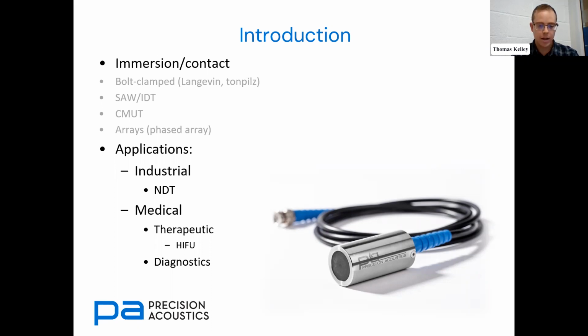Having said that, medical diagnostic applications, they quite often use arrays. I'm not going to talk about arrays too much today, but they are contact transducers typically. So there's a bit of an overlap, as there are with a lot of things in transducer design.